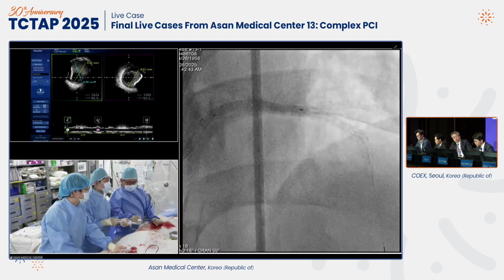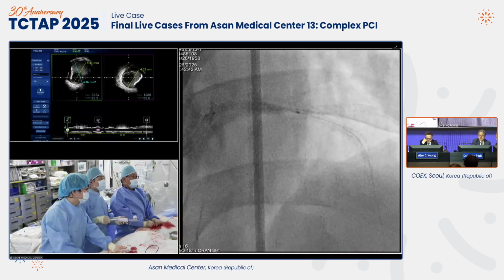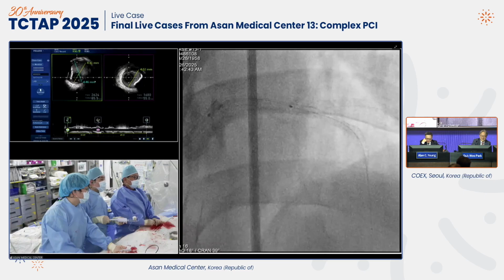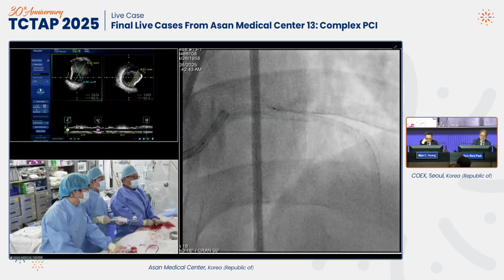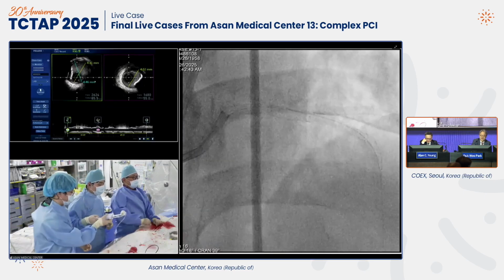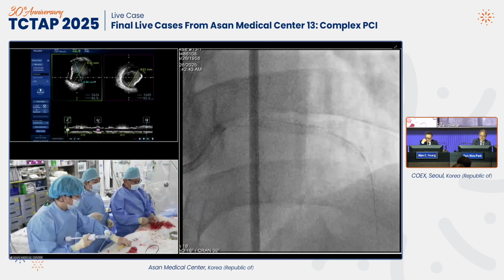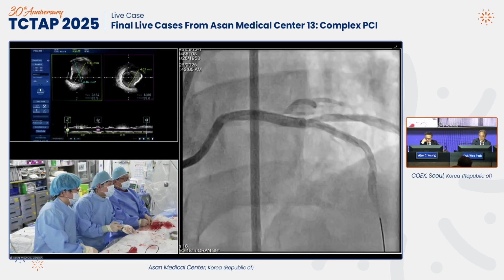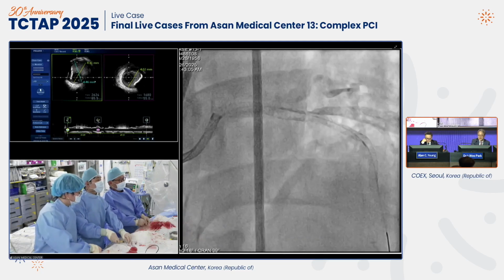I think you can see the crushed diagonal stent a little bit, at the little radio-opacity there, that line. Crush the diagonal. Sometimes you can see it, sometimes you cannot, depending on the angle. But this one, I think, you can see the crush. Okay, good. Everything is fine.